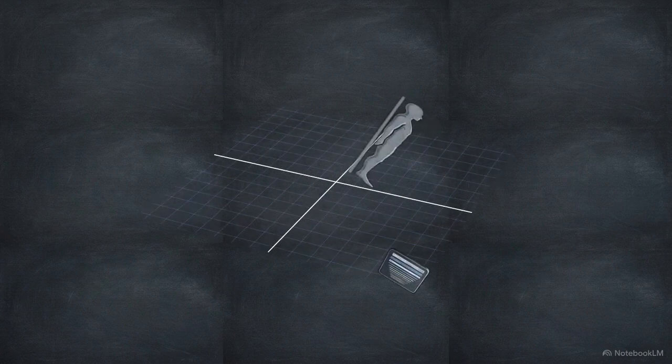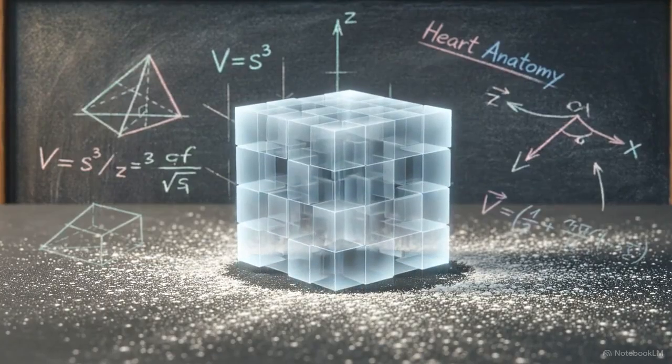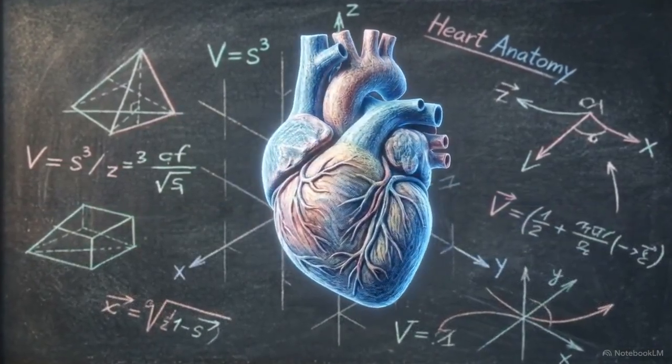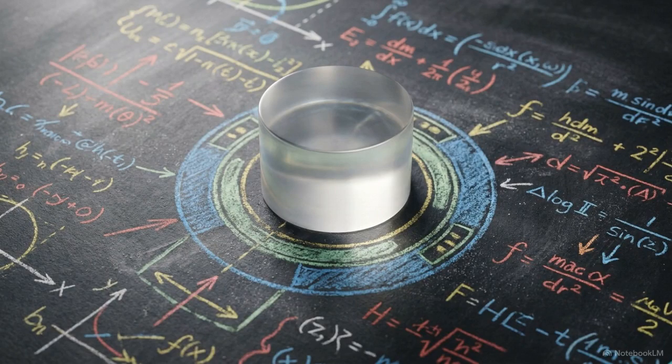When you match that thin Z-axis slice to the tiny XY pixels of the transaxial plane, you create the isotropic voxel, a perfect mathematical cube. Securing this isotropic cube is a clinical necessity, allowing radiologists to perform 3D multiplanar reformatting without introducing any structural distortion. We evaluate the success of this geometry using a completely uniform substance, like a water phantom. This introduces the primary antagonist of image quality, noise.